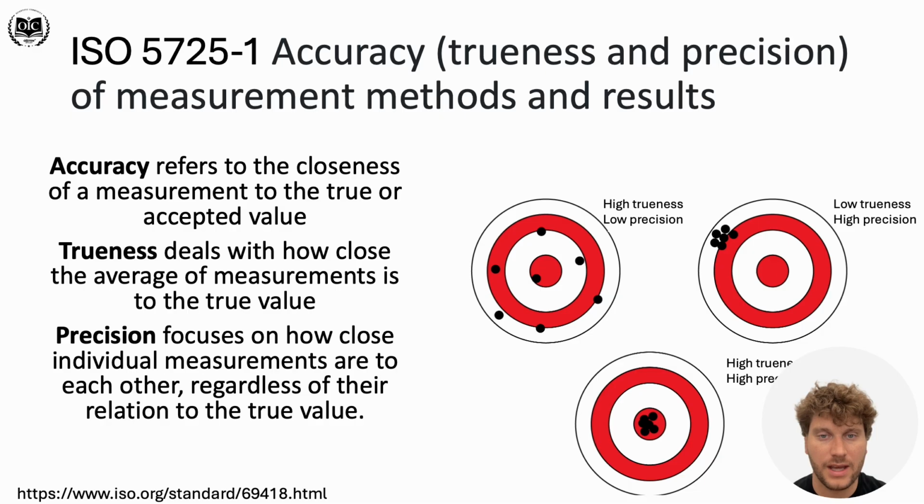And for cases and scanners where we have high precision but lack trueness, you can also expect errors, and these errors will always be in the same direction. For example, with 10 scans, every scan of these 10 cases will be shortened, or shrunk, three-dimensionally. So we strive for high trueness and also high precision, and then we can call our workflow highly accurate.